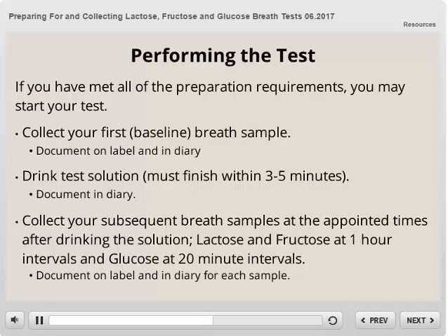After drinking the solution, you will collect your subsequent breath samples at the appointed times. For the lactose and fructose test, this will be at one hour intervals. For the glucose test, this will be at 20 minute intervals. Setting a timer is helpful to not lose track of time. Please make sure to label each tube as you collect it and document in the patient diary.